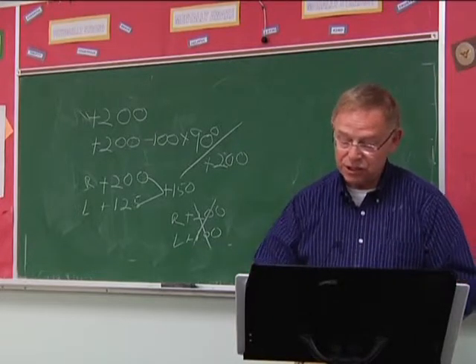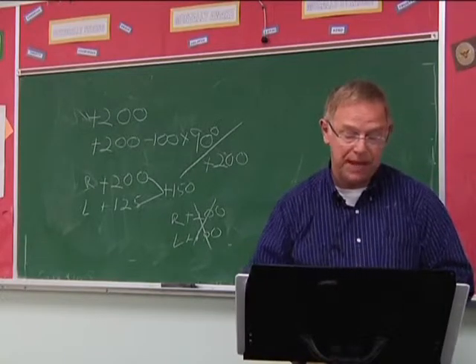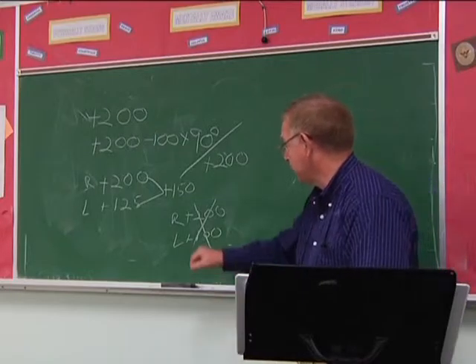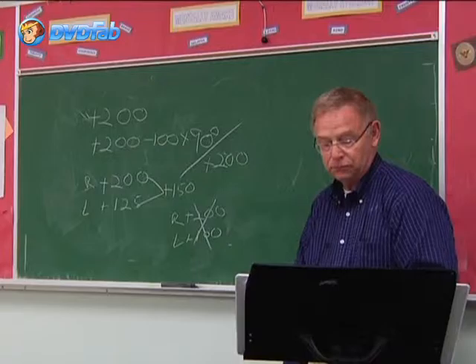So as I said, this is the criteria that I use. I can't really justify it, but that makes sense to me. Now, the one pair that you reject right there, if you had the jig and you were cutting your own lenses and frames, that'd still be a pair to keep and use with that, right?